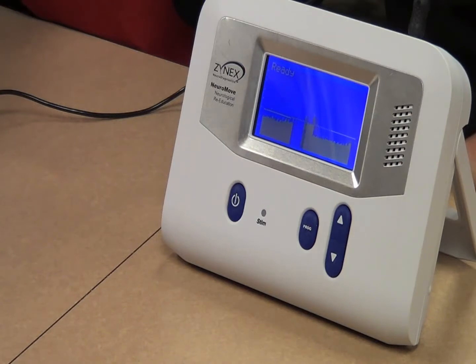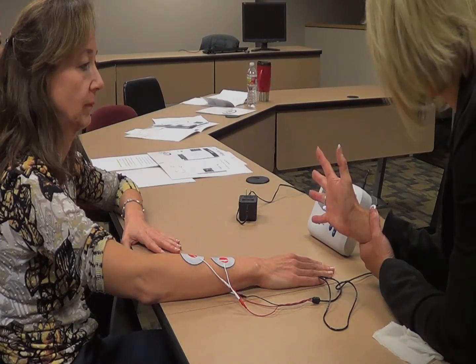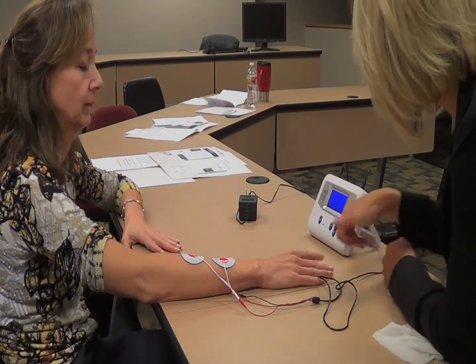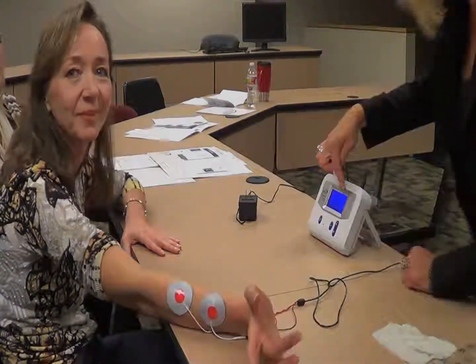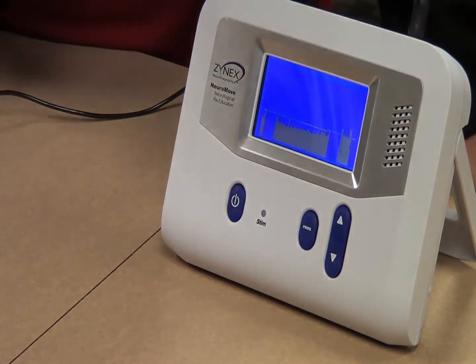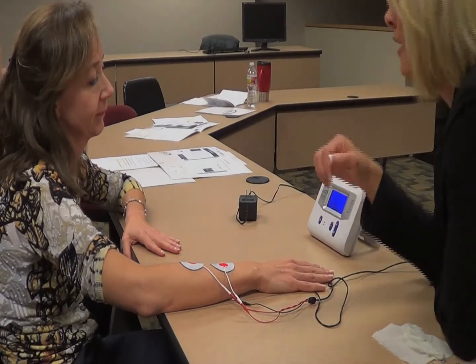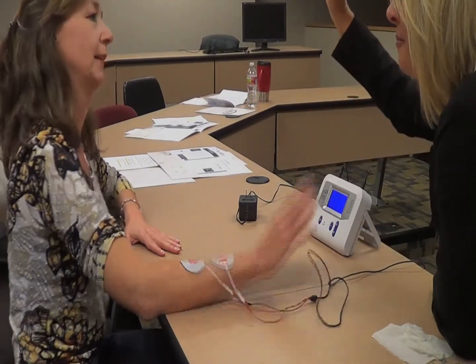Okay, go ahead. And I want you to just reach up and grab that rock and fling yourself over the top. Good. Do you guys see that difference there? Now see, that is what you want. You want that nice low stuff and then real differences. She's got real good visualization, so that's perfect. Okay, we'll switch out. Good job.